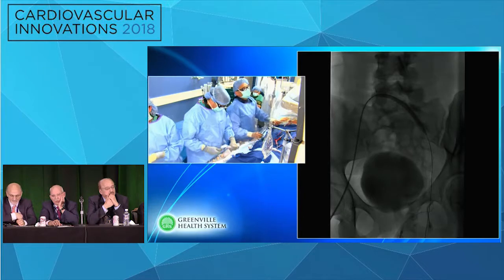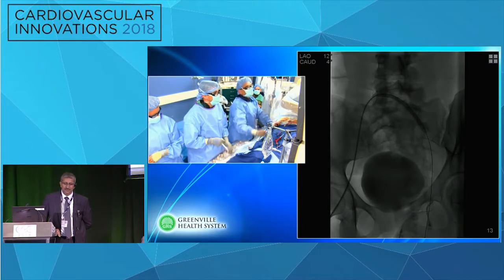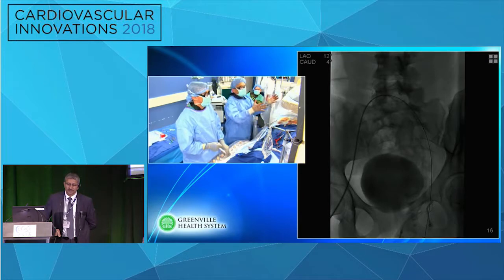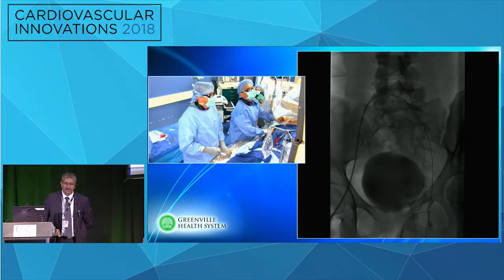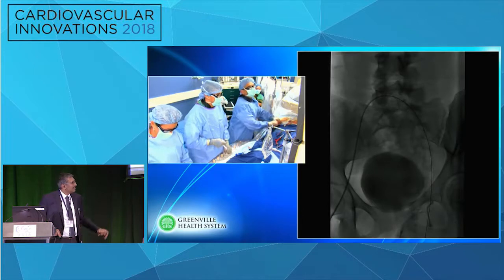My initial strategy is, if I had to stent down low towards the inguinal ligament, I wanted a 14mm stent down by the inguinal ligament. And then I was going to come retrograde and put a 16mm stent up into the IVC. When you expand the wall stent, you flower it out and then bring it back to exactly where you want it. And if you have angiographic landmarks, you kind of know exactly where you want it. Any other thoughts on sizing?